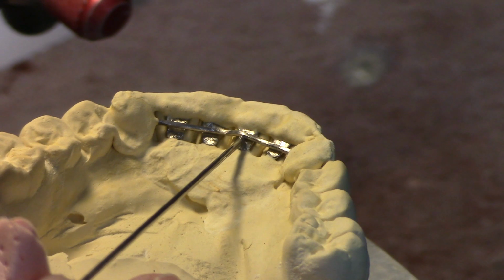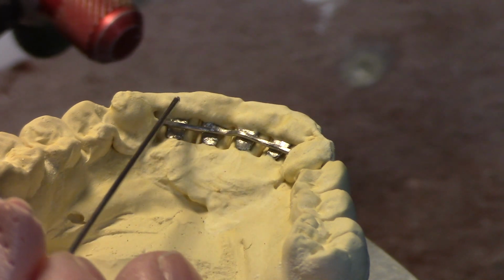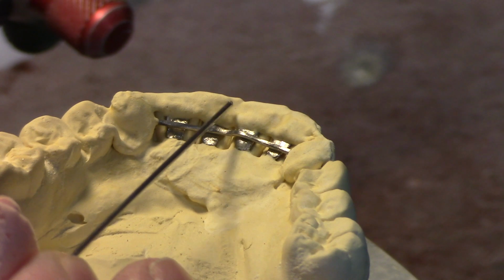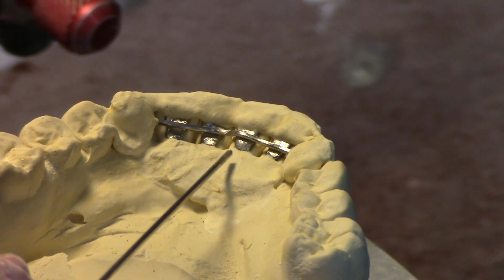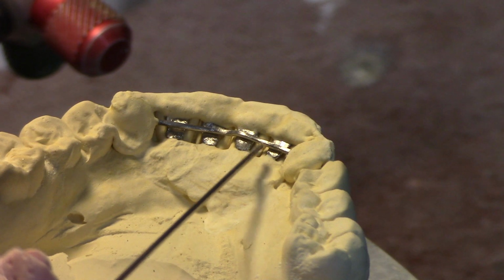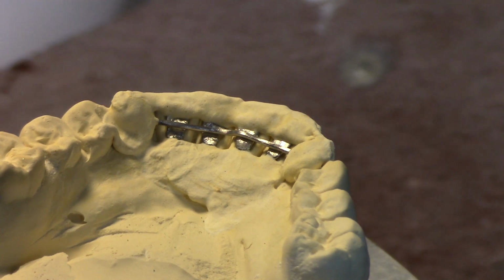But if I try to solder it with just the super glue, I've tried that before, and the super glue breaks down and the pad can move around. So I don't want it to move around. So then I put some stone on the superior side of it and just got a little bit over it on the edge just to hold it down, and also put a little bit of stone down here, just touching it just a little bit just to hold it down, leaving as much soldering surface as possible. Now I've roughened everything up so it's a good soldering surface.